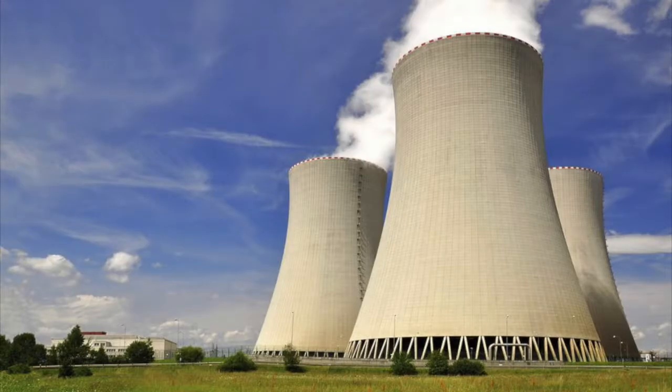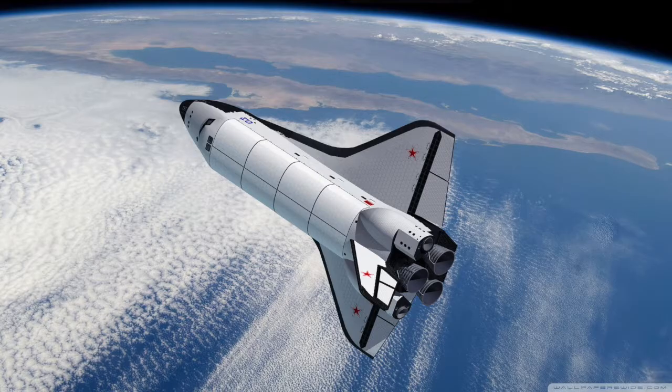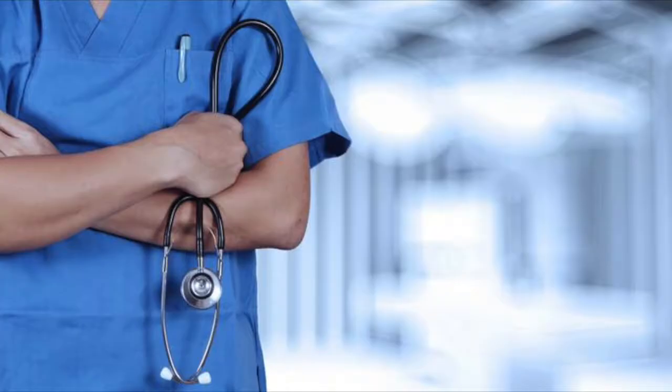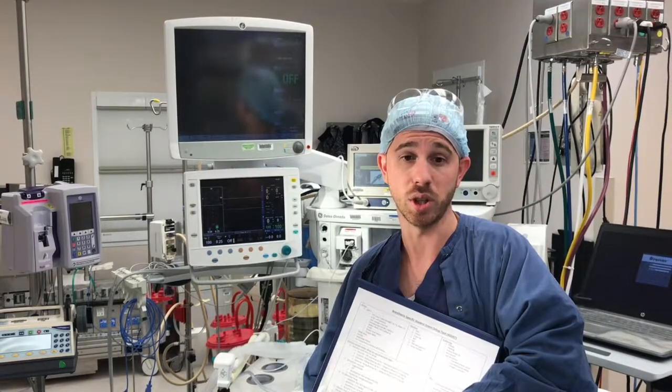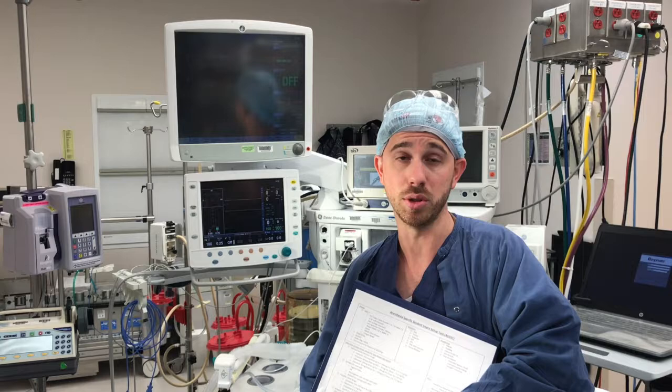Multiple industries that are known for their strict adherence to safety procedures, such as aviation, nuclear engineering, aerospace engineering, and healthcare, utilize checklists as a mandatory safety measure. Checklists reduce the need to conceptualize and recall information and are developed to reduce human error. Since thorough preparation and complete room setup is necessary for the safe delivery of anesthesia, in the effort to aid new nurse anesthesia students with proper room setup, and with the goal of decreasing the incidence where components of room setup were omitted, the ASSIST tool was conceived.